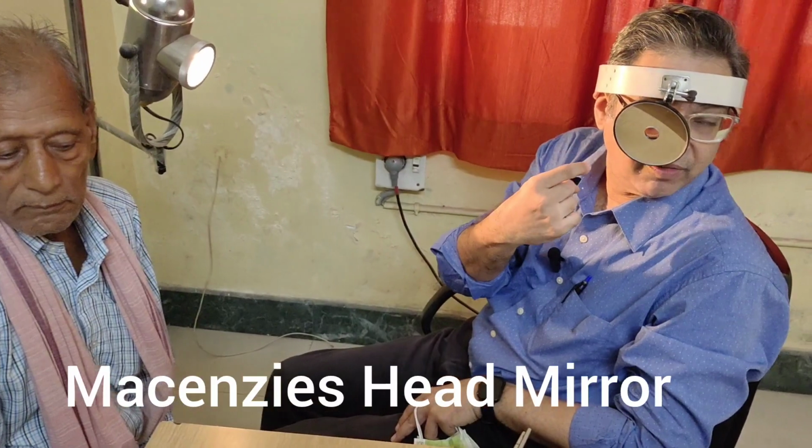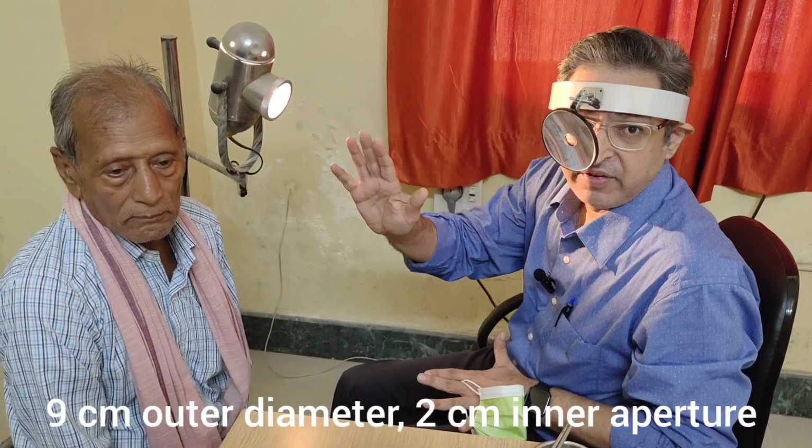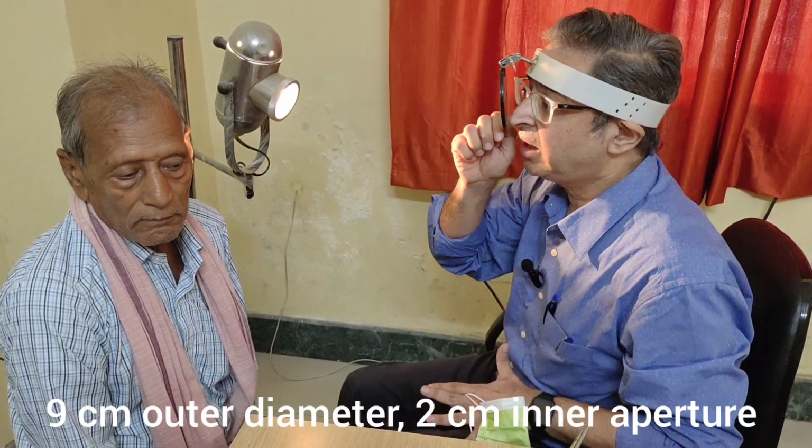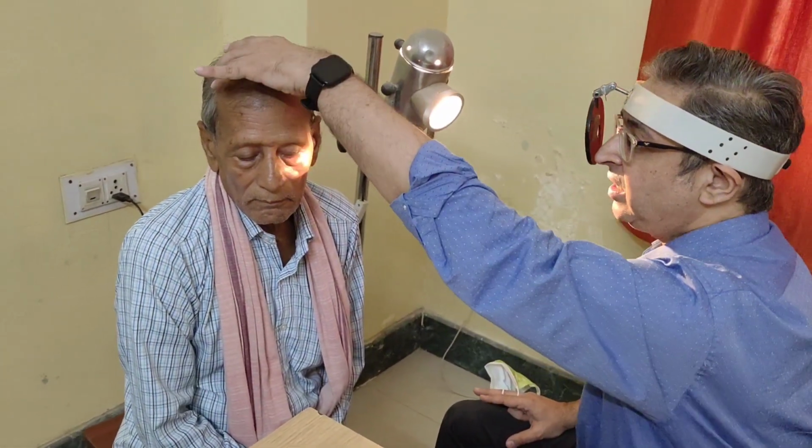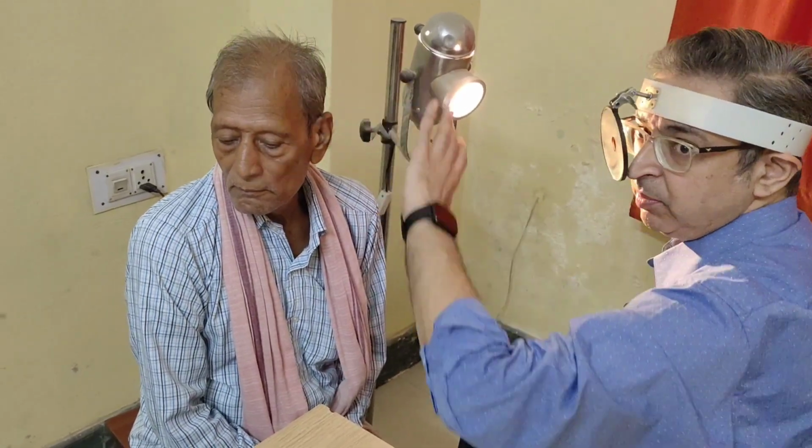This is the Mackenzie's head mirror, which has a concave mirror. It is 9 centimeters in diameter, the aperture is 2 centimeters, and the focal length of this mirror is 25 centimeters. At 25 centimeters you will get a good focus, and the part that needs to be evaluated is focused. In this case, we are examining the left ear of the patient. The patient is seated straight in front of you with the head tilted. You should not move the body.